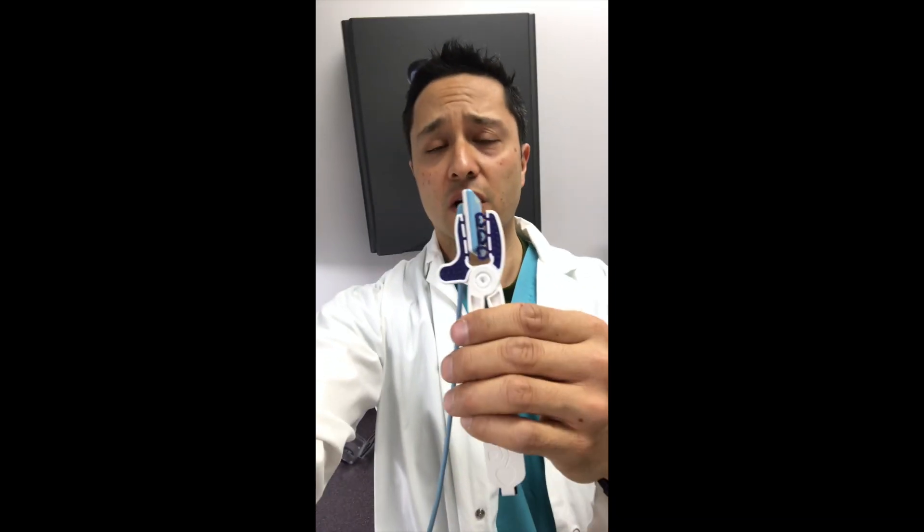Or the good old crocodile teeth — well, these are not crocodile teeth anymore, they're like dentures. And this device helps you place it easily into the patient and get an x-ray the first time.